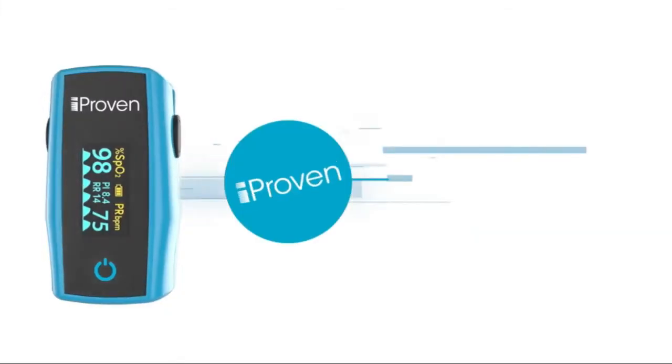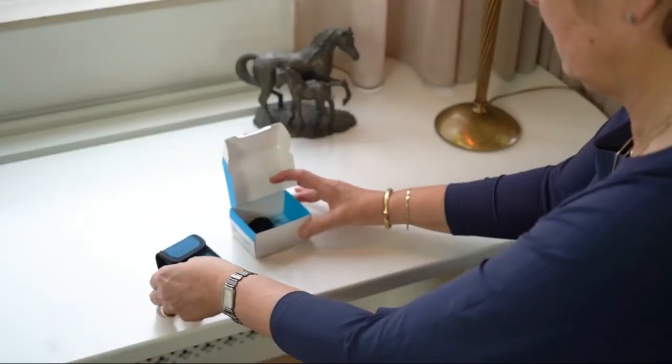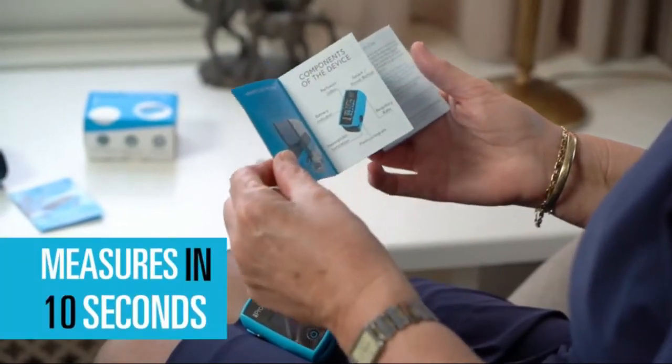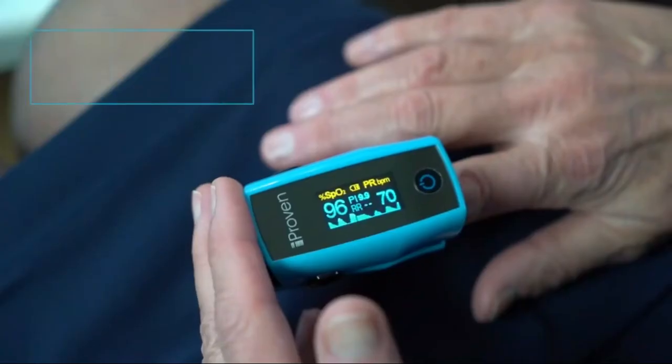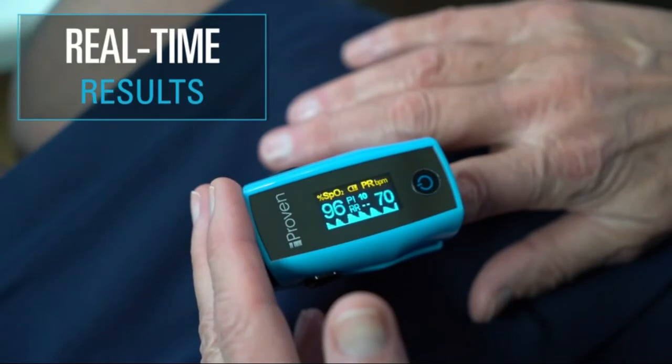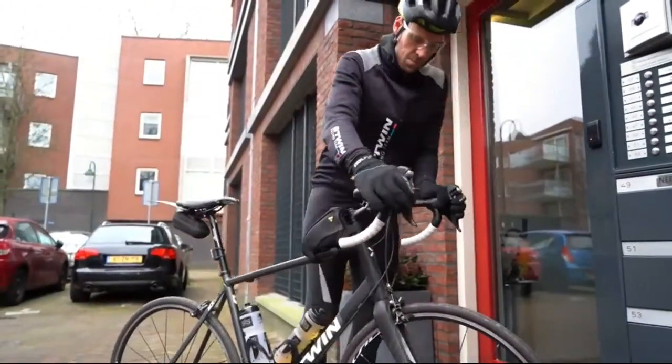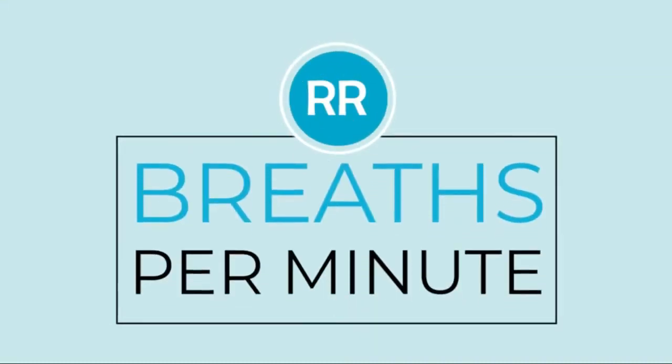Proven finger pulse oximeter blood oxygen monitor which measures respiratory rate, oxygen saturation (SP02), perfusion index, and pulse rate. Includes batteries and lanyard — OXI 33. Fast and accurate: know your oxygen saturation, SP02, and pulse rate in less than 10 seconds with the fast and accurate OXI 33 Oxygen Monitor.